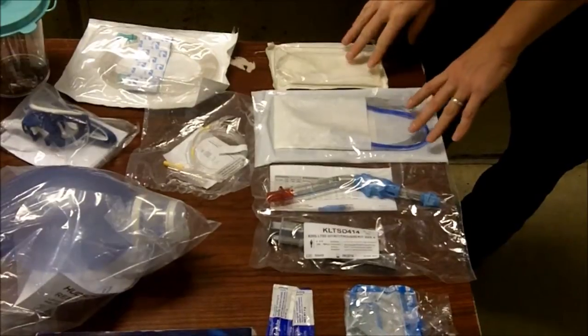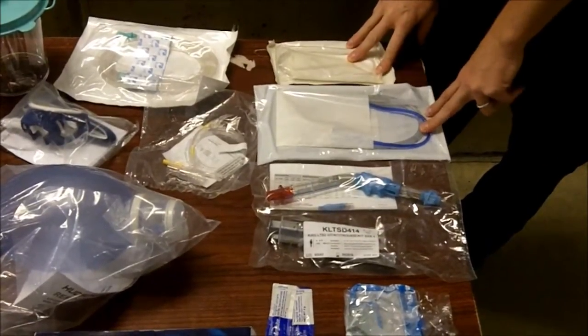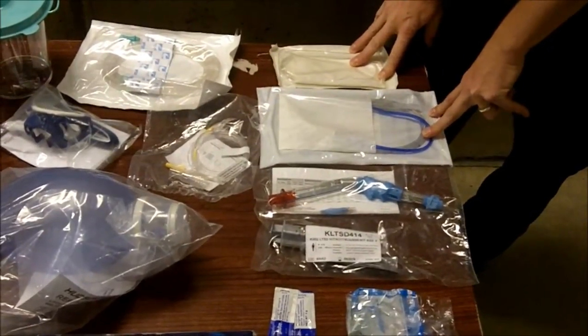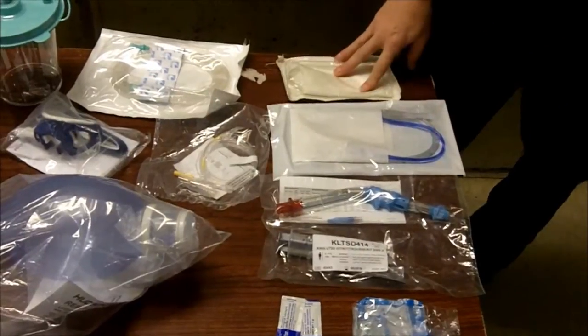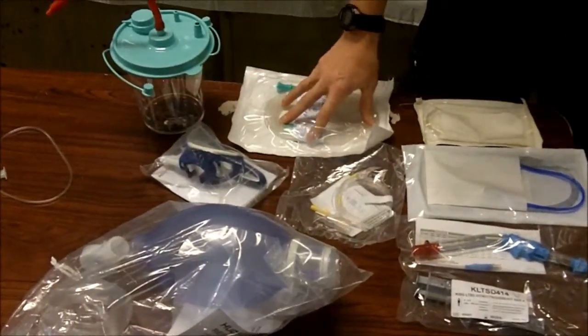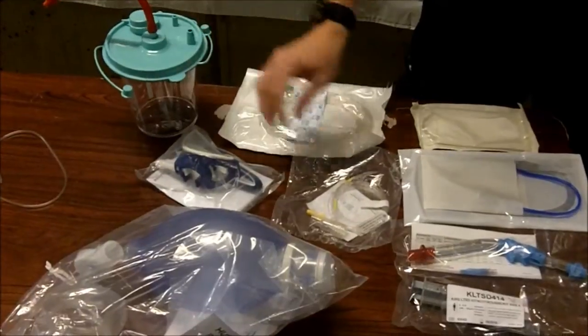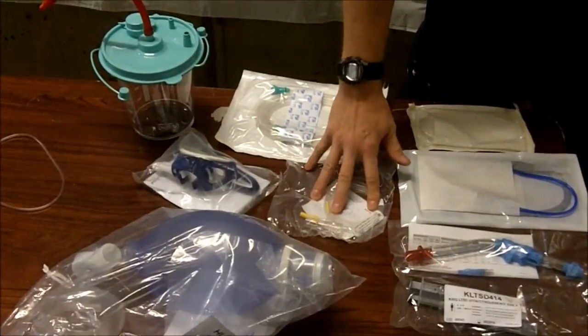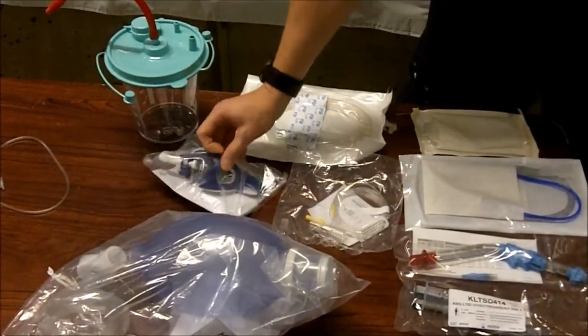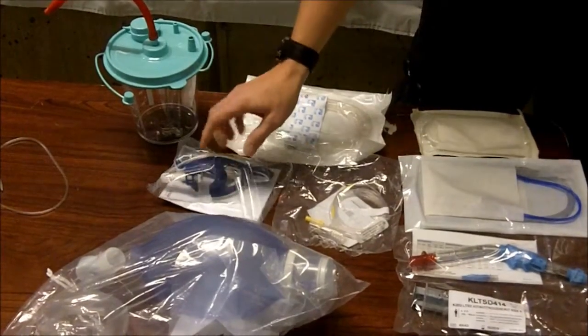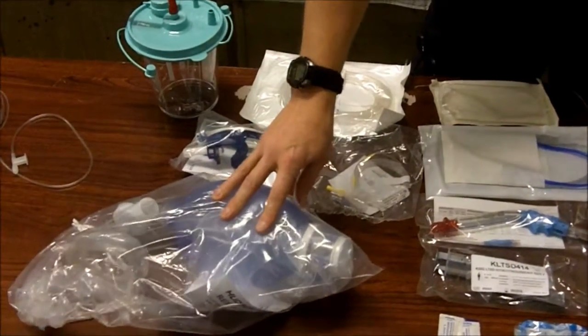Additionally, some of the advantages of the King airway: this is a Salem sump or an NG tube or OG tube, and this here is a French catheter, suction tubing, suction canister, end-tidal CO2 monitoring equipment, and our tube securing device. And of course you will all recognize the bag valve mask.